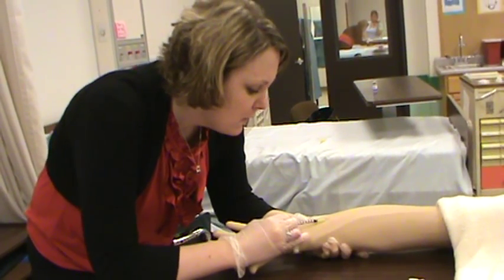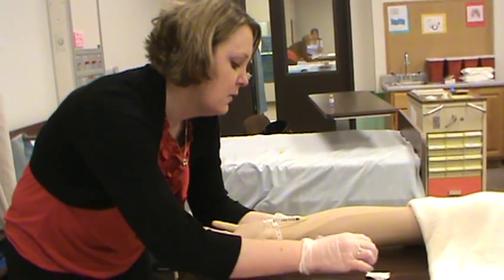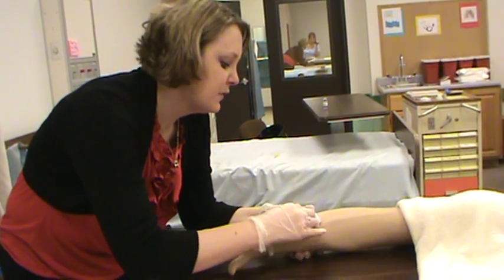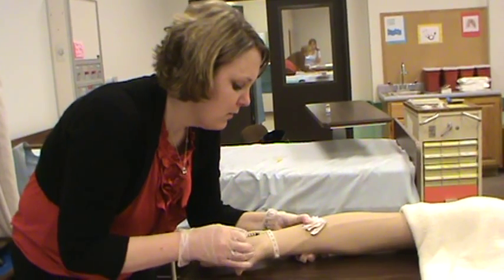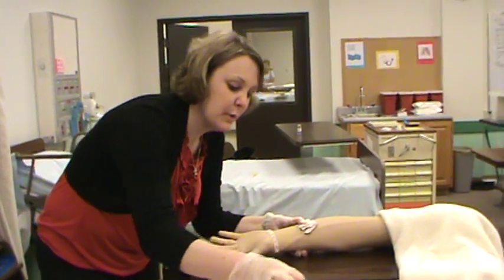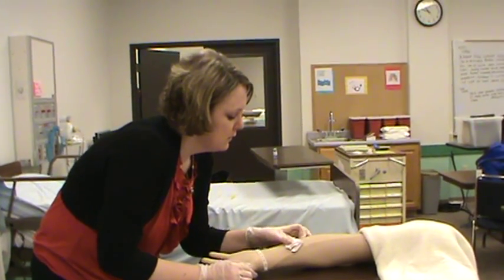Okay. Place alcohol swab over the needle insertion site. Withdraw the needle quickly at the same angle as it was entered. So take a new alcohol wipe, and just go ahead and place it over this. Withdraw it at the same angle. If I had a safety device, I could activate it or immediately place this in the sharps container. Do not massage the area after removing the needle.